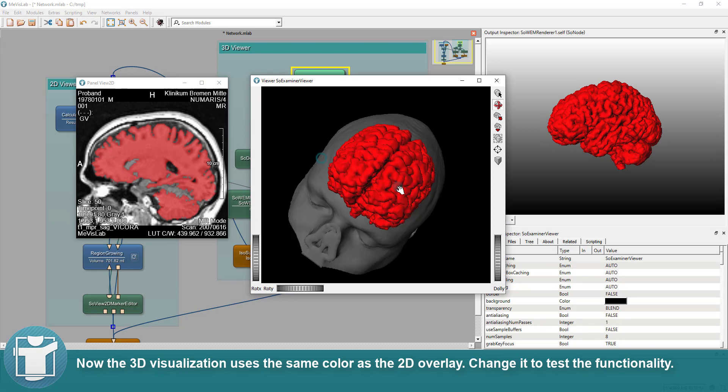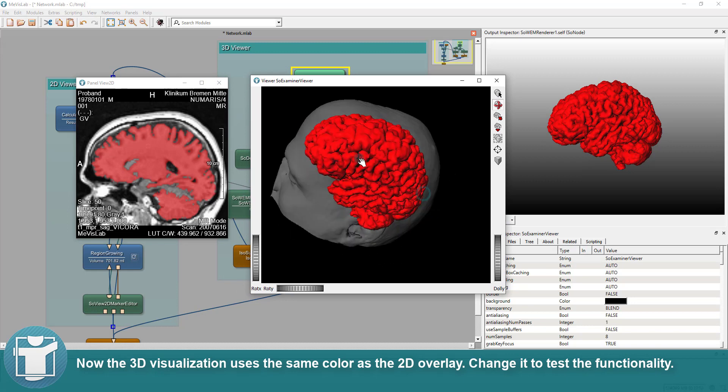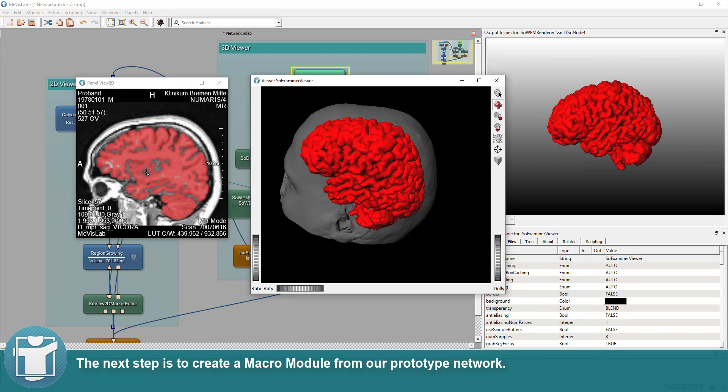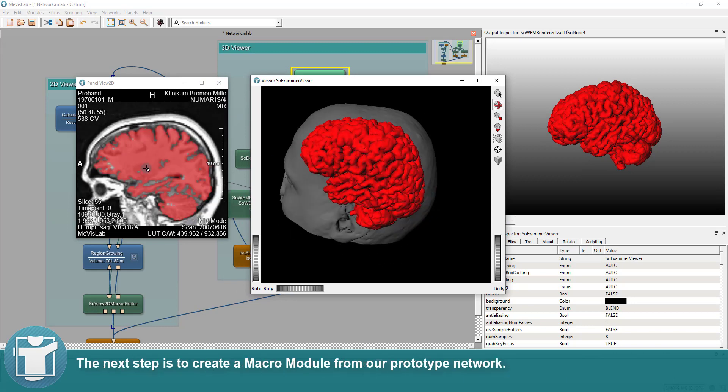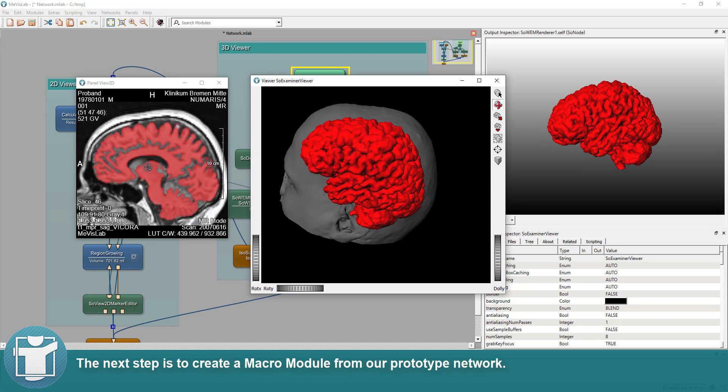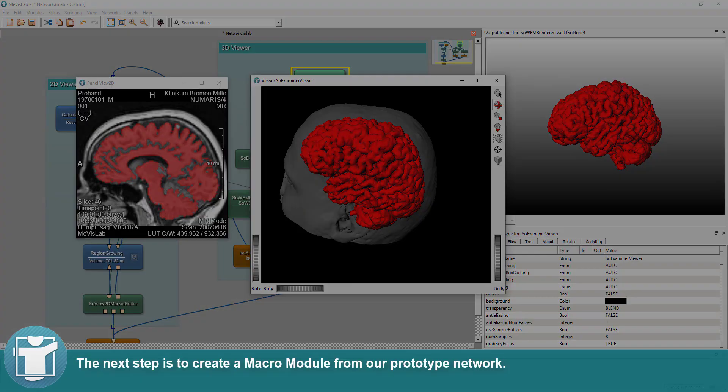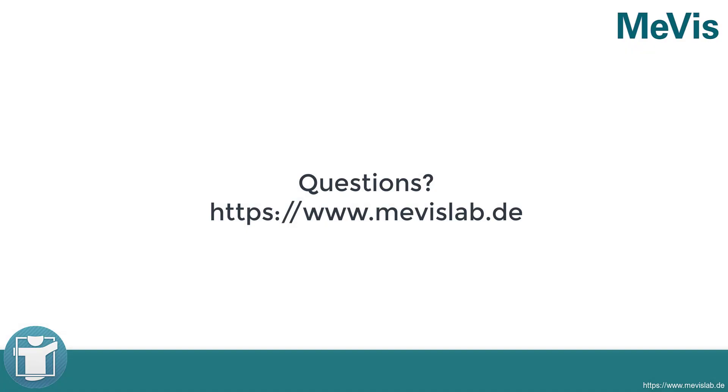Change it to test the functionality. The next step is to create a macro module from our prototype network. For further information, please have a look at www.mevislab.de.